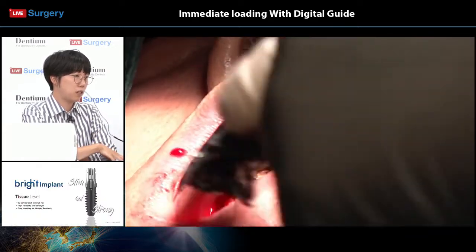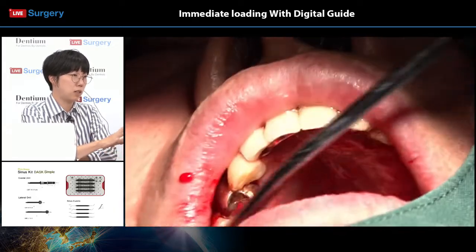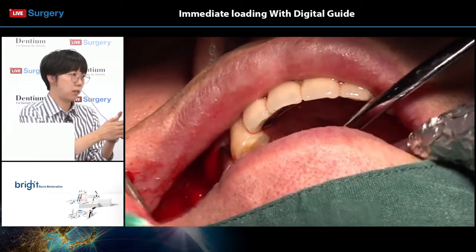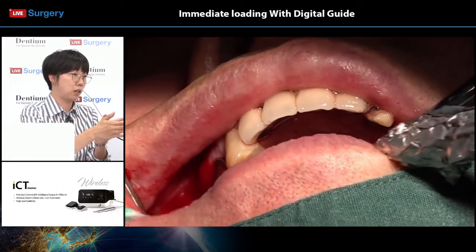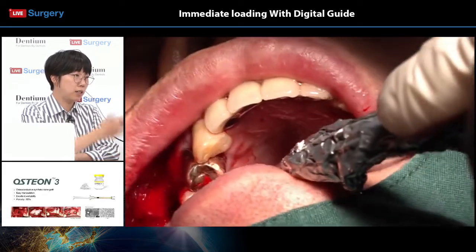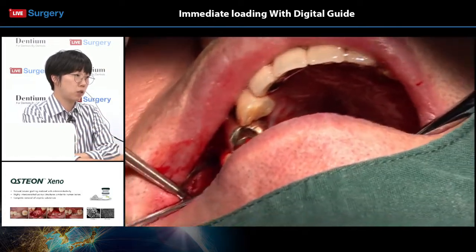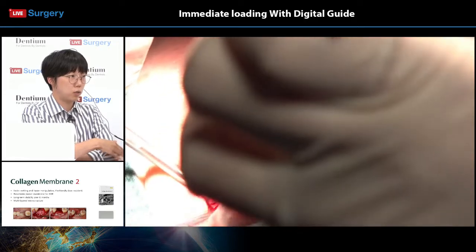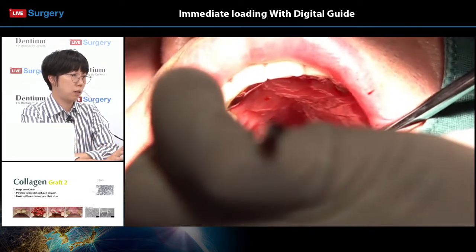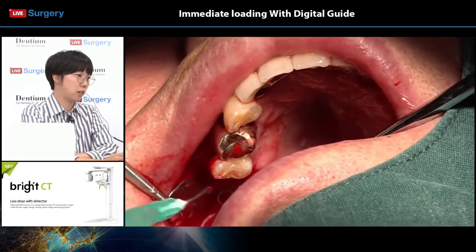In devastating cases, when there is something wrong with the digital guide or the surgical procedure itself, when you reflect the flaps, you see implants that are positioned out of the bony housing. So that means that in some process, something went wrong. And it's always important for the surgeon to backtrack through the whole surgical procedure and to determine at which moment he or she had made a mistake.